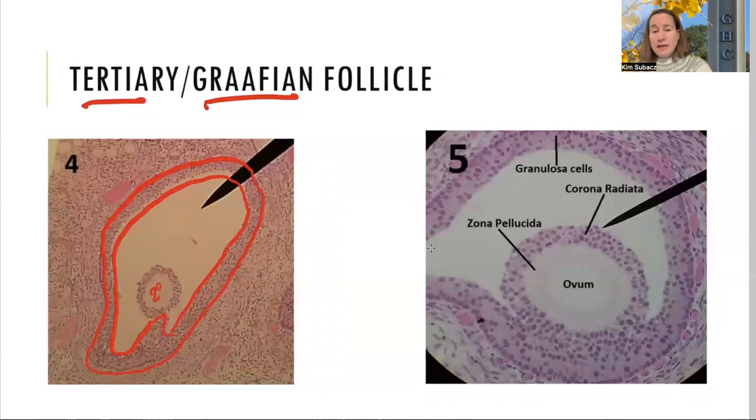Then check out the egg too. So on the egg, it is going to have layers. So here is our oocyte. Here's our little ovum. And again, it's a secondary and it's stuck in metaphase 2 of meiosis. We need to know the layers outside the egg because even outside the egg has developed now that we are grown and mature. So this has this light colored area.